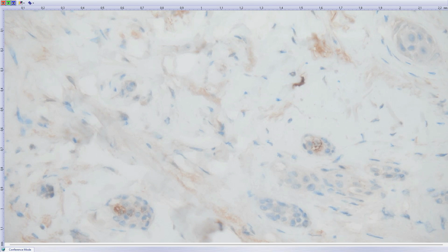We have many of these tumors in our files, and I don't remember seeing sebaceous differentiation in them, but this should not be surprising because these lesions are definitely not of eccrine origin; they are probably of hair follicle origin.